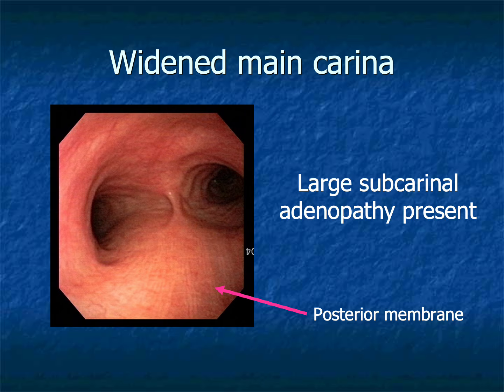The widened carina shown here also demonstrates an important principle. Anatomy can reveal pathology indirectly. Subcarinal lymphadenopathy may distort or broaden the carinal angle before the lesion itself becomes visible endobronchially. Bronchoscopy often detects disease through altered anatomy rather than direct visualization alone.